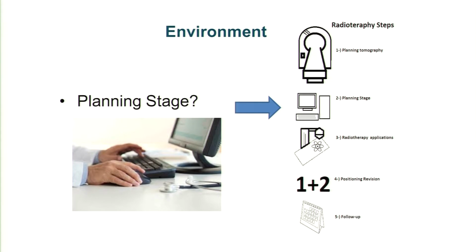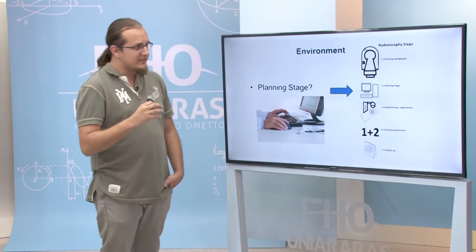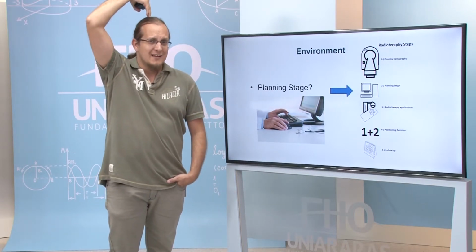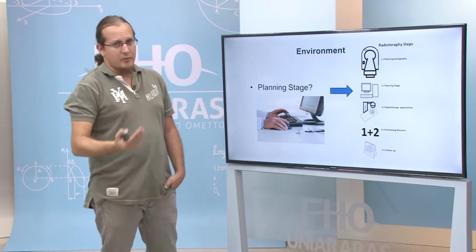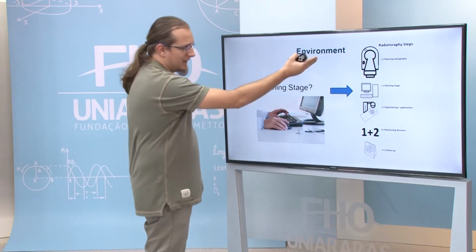In the treatment of lung cancer especially, expensive radiotherapy is used. Radiotherapy uses radiation to access the human body, and there is an important workflow for radiotherapy like this.